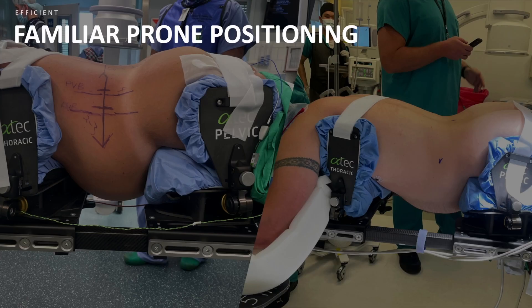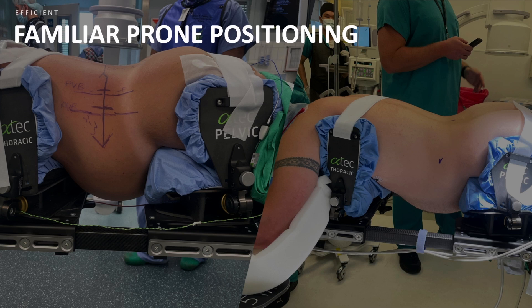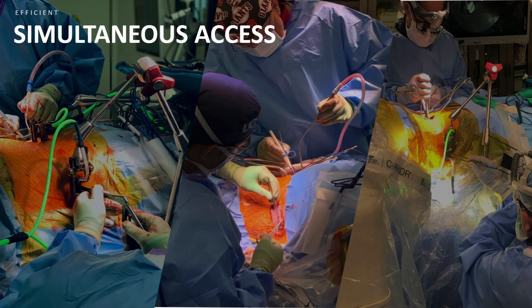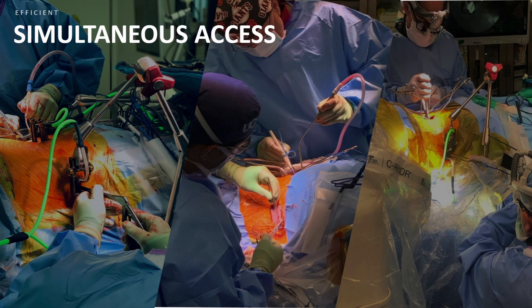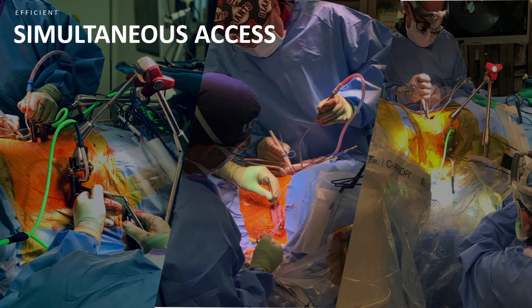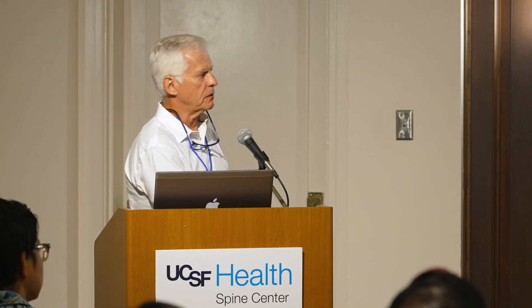One of these is the retroperitoneal space — the peritoneum, because of gravity, migrates more anterior. We have more space. Starting with the position, you see it's a very easy position compared to the lateral position. You just drop the patient in these two positioners adapted to the Jackson table. You see the belly bowing. It's very easy to see the increase of lordosis. Most commonly, the PA finishes closing the skin when the surgeon is already opening for the posterior part of the procedure.